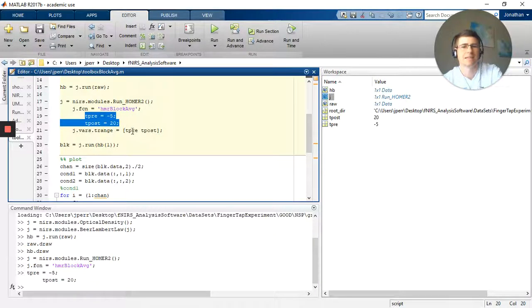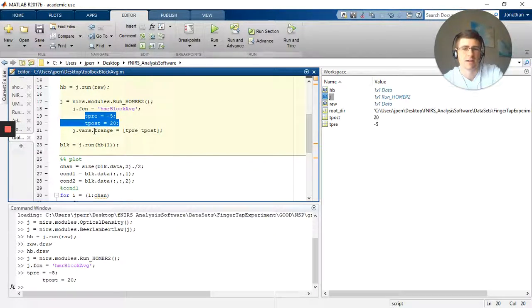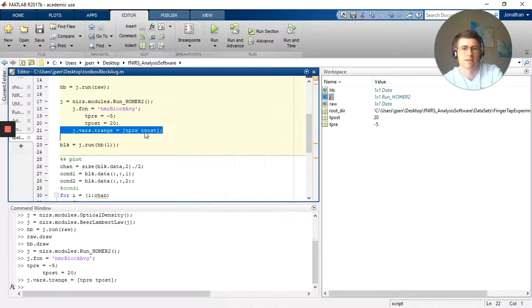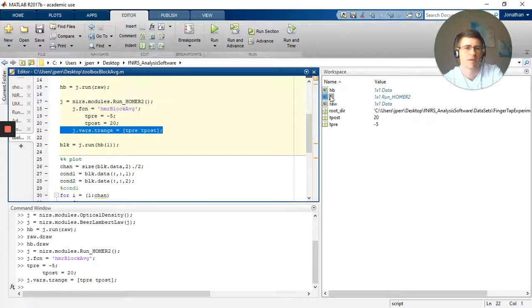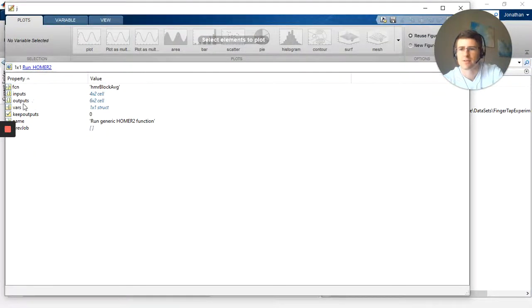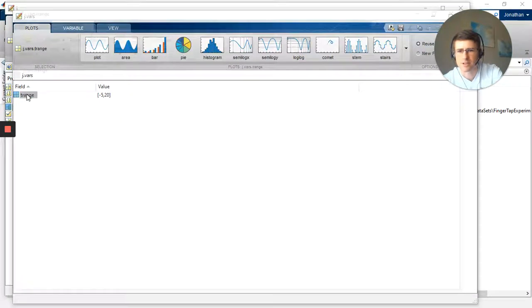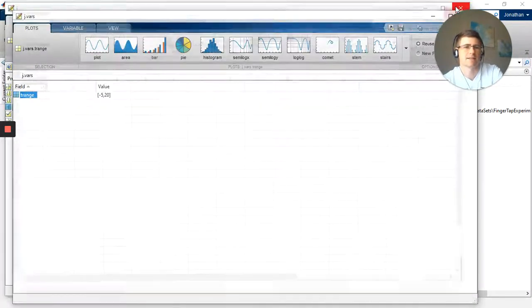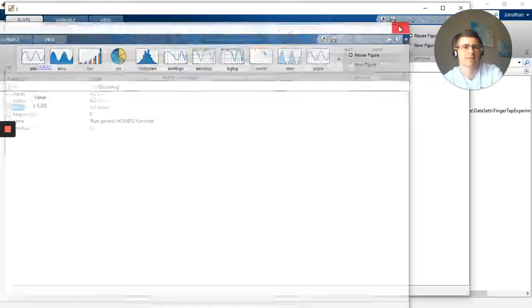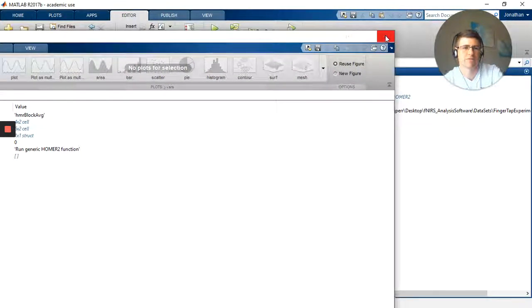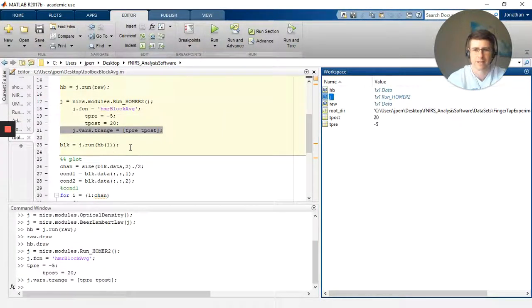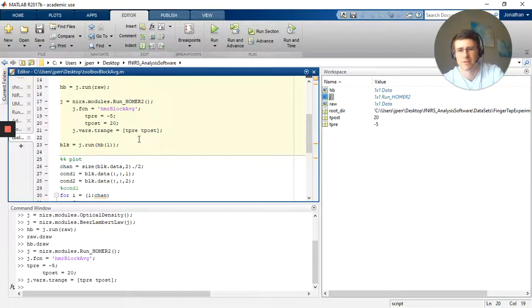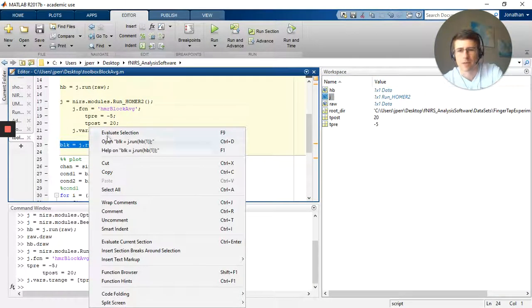I'm going to put it into that empty variable, j.vars.trange, and I make an array using those. So I go back in, go to my variables, go to trange. There it is, negative 5 and 20. That's exactly what I wanted. So what my block is going to look at is time points negative 5 to 20. You will possibly want to change that, but that's fairly reasonable values.